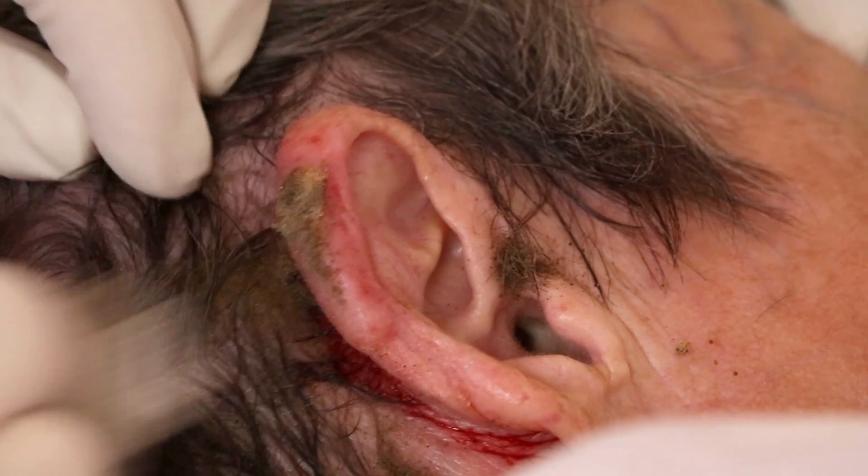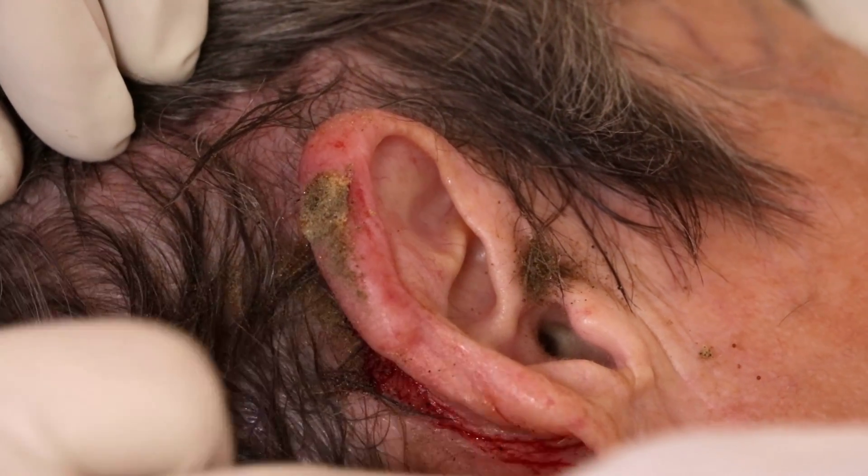It's a brown powder that helps to stop the bleeding, and it scabs up very nicely. It's kind of hard.